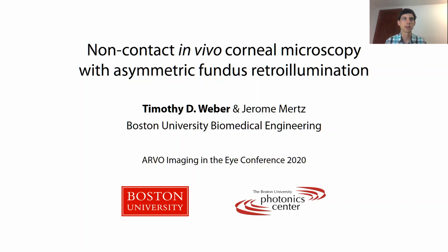It's a bit unique from other corneal microscopy techniques in that we use transmitted light rather than backscattered light to form images. We call this technique asymmetric fundus retroillumination, or simply retroillumination microscopy for short.